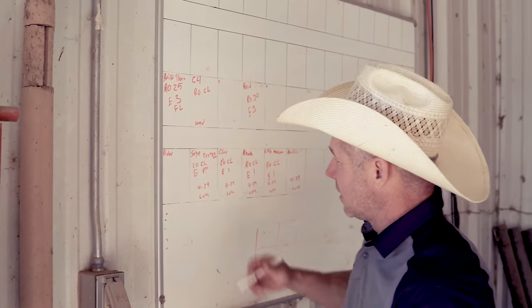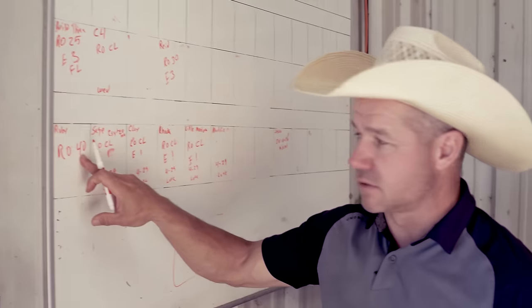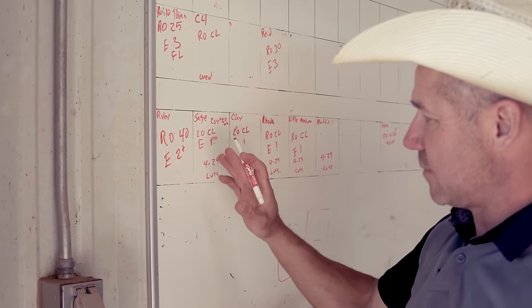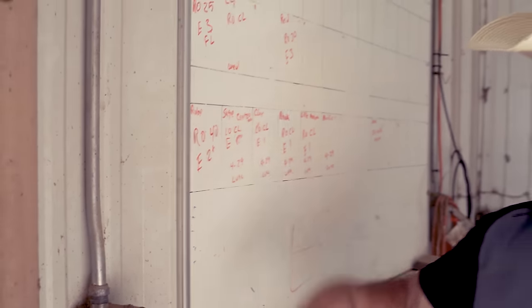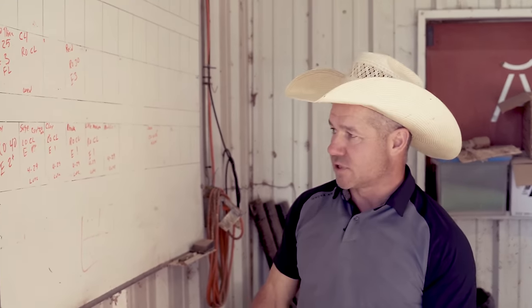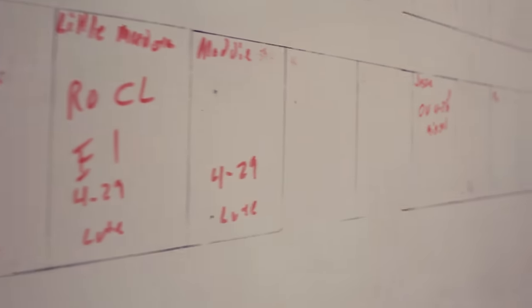Okay, so that was on a right ovary. So I go RO, right ovary, 40. So 40 is the size of her follicle. And then I'm going to go with the edema, E for edema. And she was a 2+. 3 is better, 2+ is good. So that's kind of my note for now. And that means she's definitely a breeder for right now. But we've got a handful more mares to check. And we'll see where they're all at and make a game plan from there. Because we might have to collect that one stud and breed maybe four or five mares.